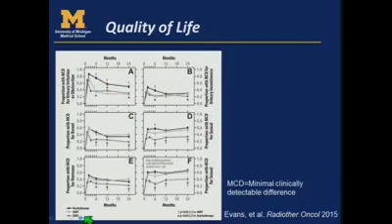And you can see that looking at the 3 different modalities, many of them are very close together. With SBRT, which is the dark gray, sometimes it falls out a little bit better in some of the different metrics. But overall, it's pretty much right on par for all the different therapies. There was a concern with higher doses per fraction in the normal tissues nearby, especially the rectum, that quality of life might actually be worse for SBRT. So this is reassuring.